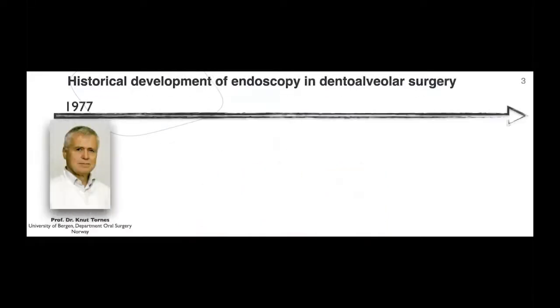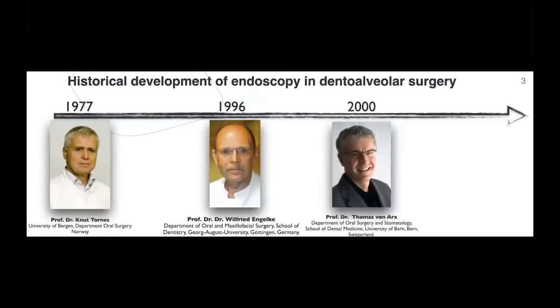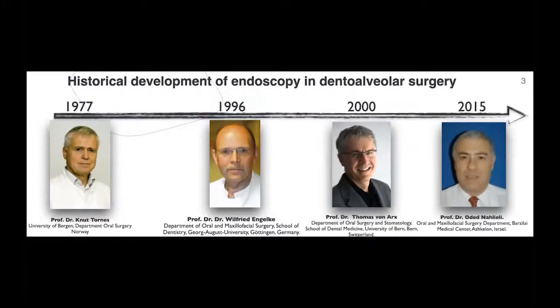The development of endoscopy system in the dental alveolar surgery in the latest years has been possible thanks to the work of specialized centers in different parts of the world. In this sense, Professor Tornes from the University of Bergen in Norway pioneered in introducing the use of the rigid endoscopy system as a support tool during oral surgery procedures, such as the enucleation of large cysts and others.